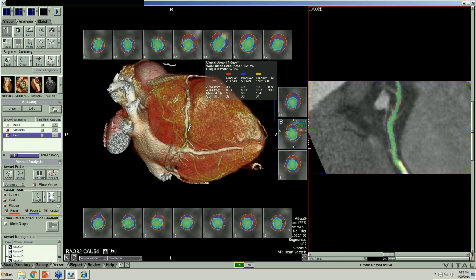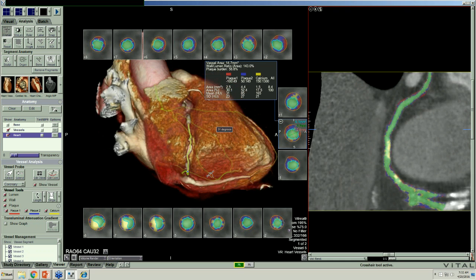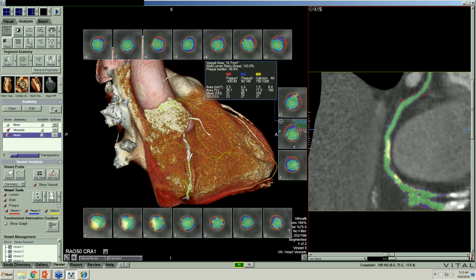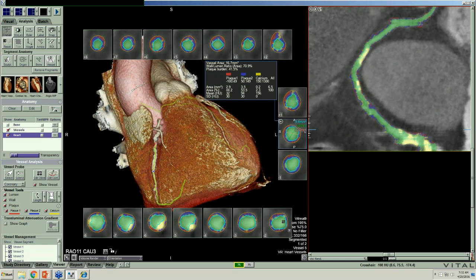And so here we go along the right. Just sort of make our way up here slowly, and a little more tedious. You can see why post-processing might take 45 minutes, because you got to make little corrections for the computer.